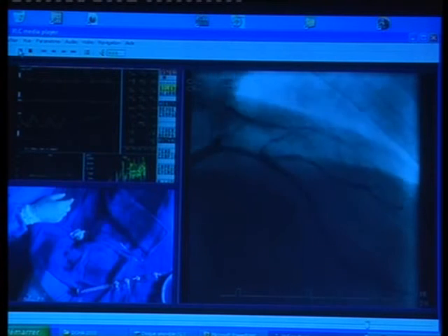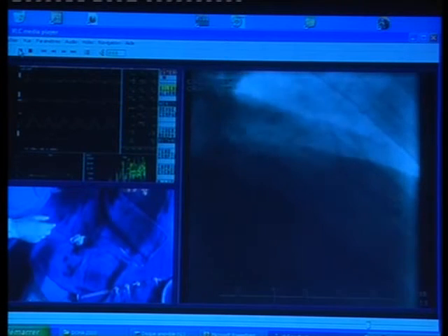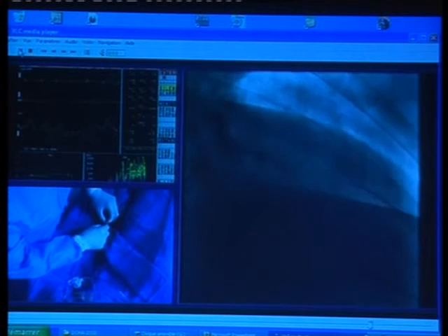At this moment, we can redo a stent boost. We re-advance the balloon and do the stent boost to see the proximal part. For doing the stent boost, we need the 2 markers of the balloon inside.